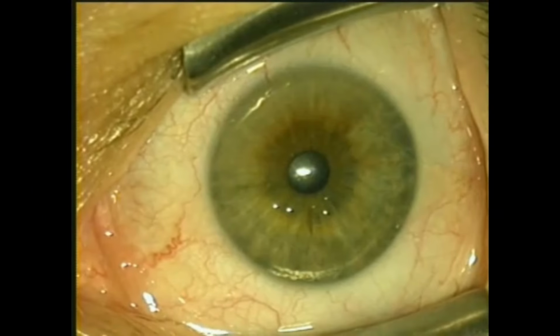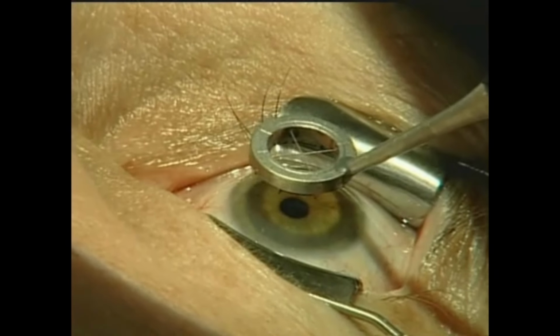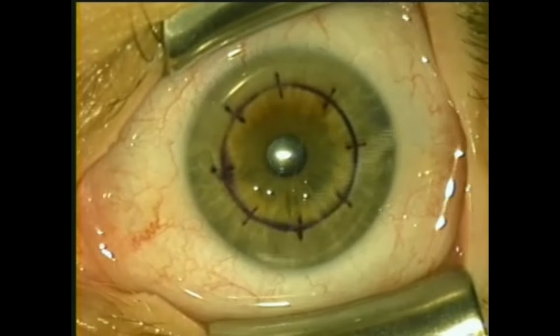With the rounded speculum in the eye, I'm going to mark the cornea with a Refractec marker. It has a series of 8 meridians marked with 3 hashes on each, and this will show us where we want to place the radiofrequency energy. So we're centering over the pupil, and you can see the 8 meridians. There's a mark at 6, 7, and 8 millimeters. You want uniform hydration of the cornea.